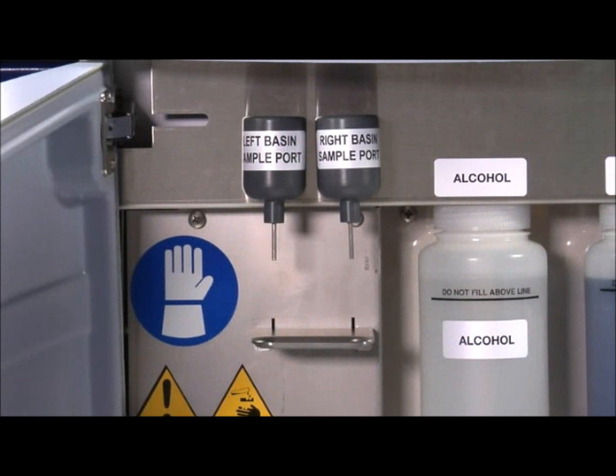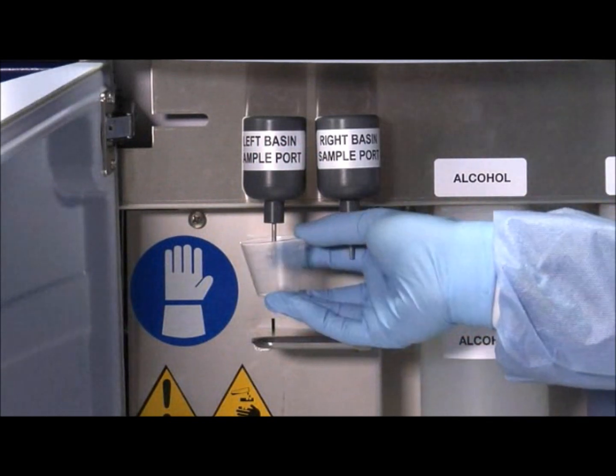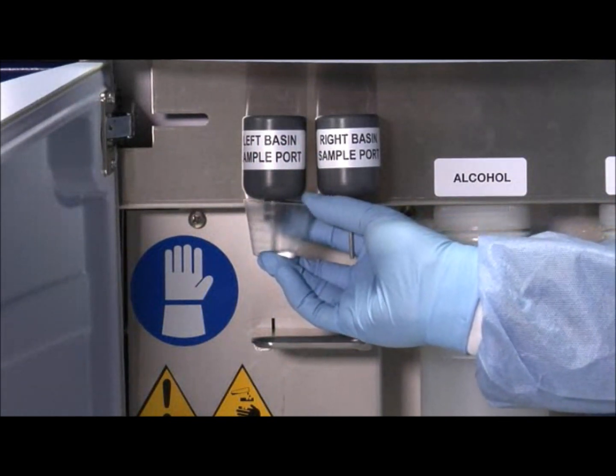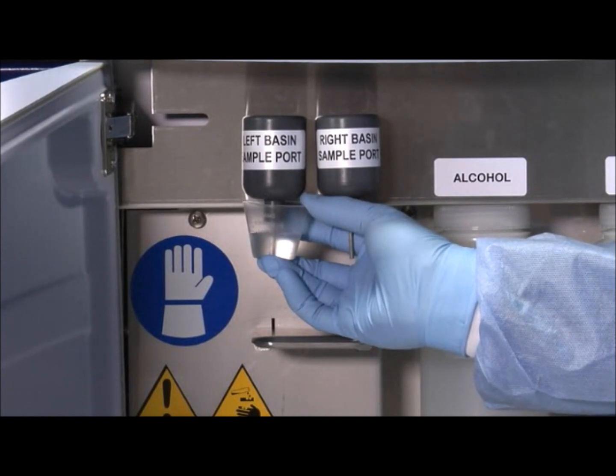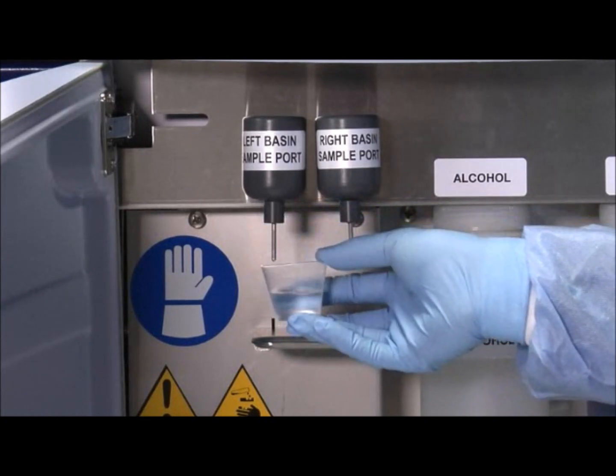Open the front access door and take a sample of disinfectant from the sample port. This is done by pressing a sample cup up against the metal prong. Fluid will be dispensed into the cup.